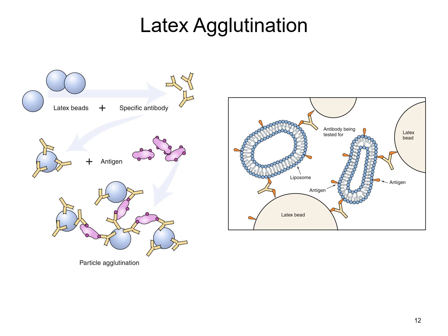I'm sure once you get to clinical, you will get the opportunity to do a few of these latex agglutination tests. Some of the more common ones you're probably going to see would be C-reactive protein, rheumatoid factor, and rubella antibody. Basically, you have latex beads and a particular antibody. Those beads get coated by the antibody, and that antibody is going to agglutinate with an antigen, and the latex beads are what will help to visualize the agglutination that has taken place.